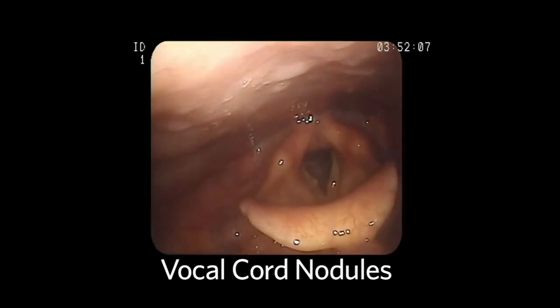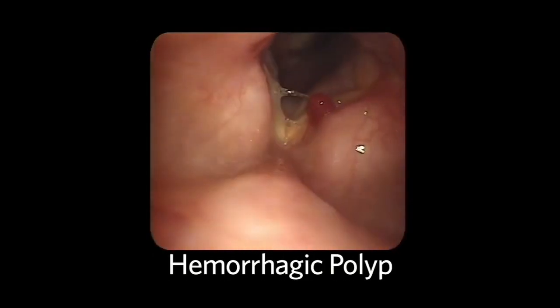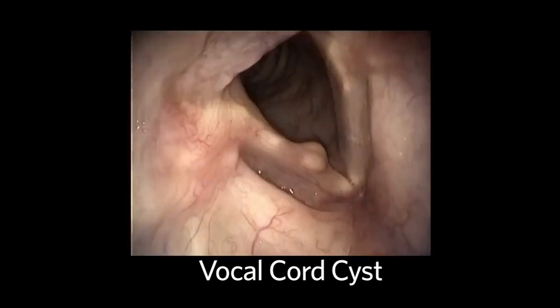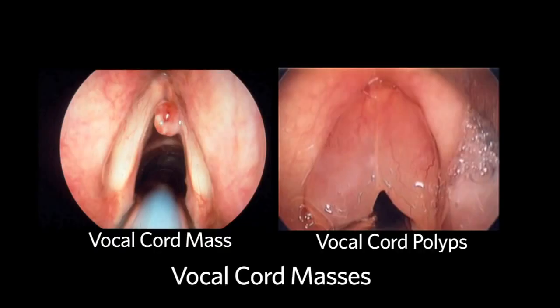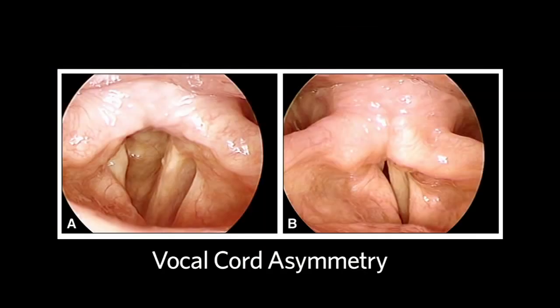Common pathology that can be seen on the vocal cords include nodules, polyps, cysts, and malignancies. In the pediatric age group, laryngomalacia is noted as a common form of stridor in infants. And irregularities such as a mass, ulcer, or asymmetry of any kind should be noted.